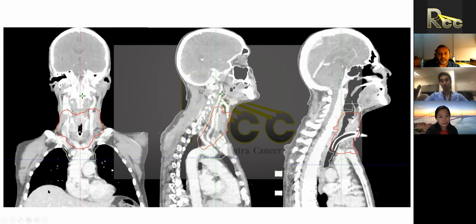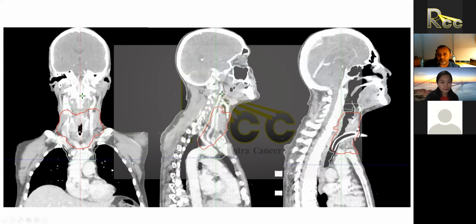So you very well spare the lateral aspects of the lungs and keep a reasonable lung DVH. The other caveat I will say: when I treat these patients where I'm treating mediastinum, I'm always going to make sure that my simulation CT goes all the way down to mid-liver so that I can accurately have a lung DVH and watch that lung DVH. I'll typically use the same parameters as in locally advanced lung cancer: trying to keep the V20 certainly below 30, around 25%, the V10 to 40%, and the V5 to 55 to 65%. So it's similar dose constraints in these patients.